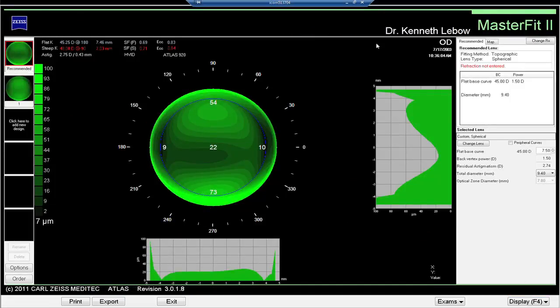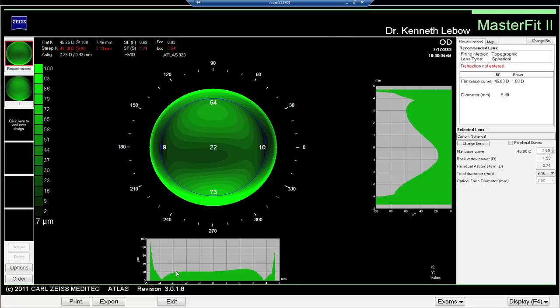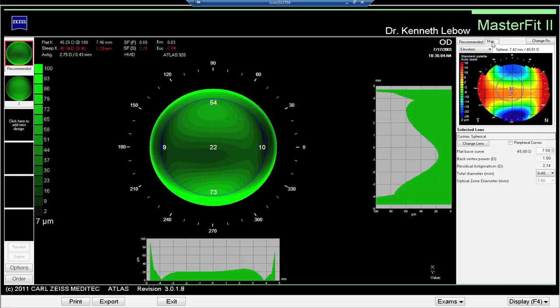The first recommendation is a spherical contact lens with a 7.50 base curve. I actually wound up fitting the patient with a steeper base curve in an aspheric design. You don't see too bad a fluorescein pattern — looking at the thickness of the tear film underneath the optic zone, it's fairly uniform, getting a little higher superiorly and inferiorly. Looking at the elevation map, the highest point is right in the center, associated with a faint area of with-the-rule touch in the center. The lower areas are superior and inferior, which is why you see pooling in those areas.